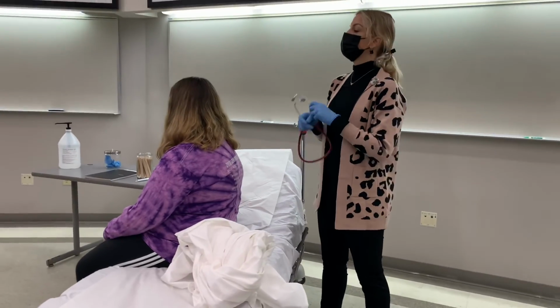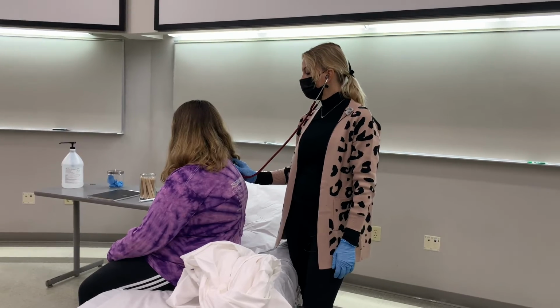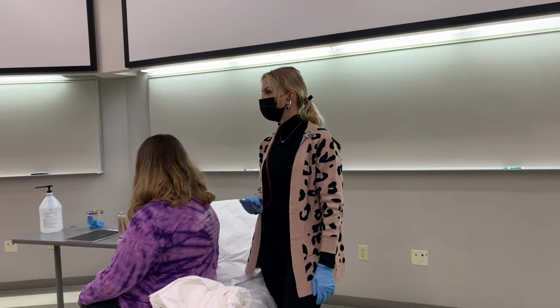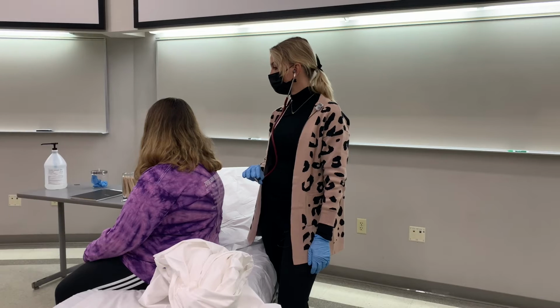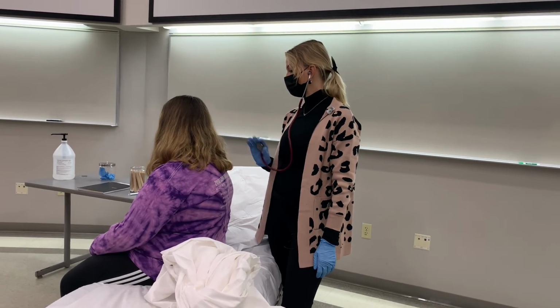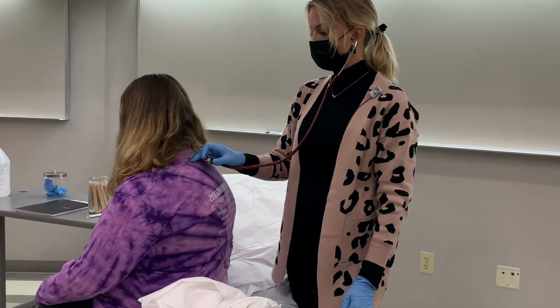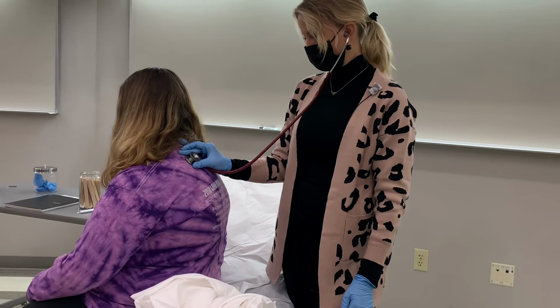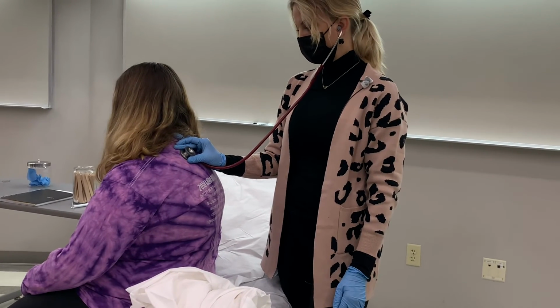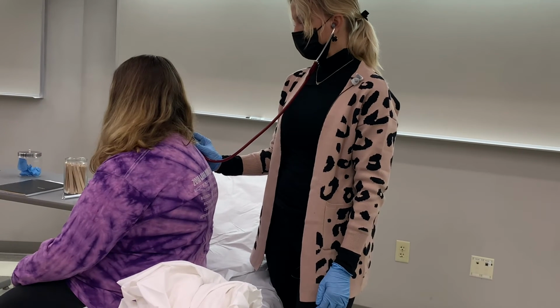So you're going to feel the stethoscope kind of hit your back. When you feel me, release it and put it on a new spot. I just want you to take a nice deep breath for me. But again, if at any time you get dizzy or you need to just take a break, that's totally fine, okay? So I'm listening in 5 spots for the full inspiration and expiration. Always listening bilaterally.